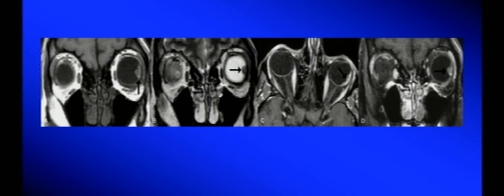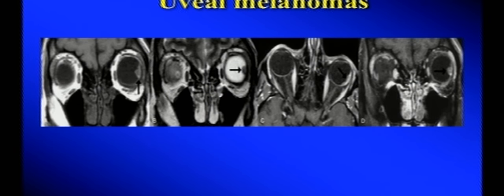Another example: an intraocular hyperintense mass on T1, hypointense on T2. With contrast and fat suppression, the muscle is hyperintense and fat is gone, but this mass takes up only a little contrast and remains relatively hypointense. With these characteristics — intraocular, T1 hyperintense, T2 hypointense — this is choroidal melanoma. Of course, for visible intraocular lesions you would not routinely order MRI; ultrasonography — which Dr. Deepak Bhat will discuss — is a much better first option.